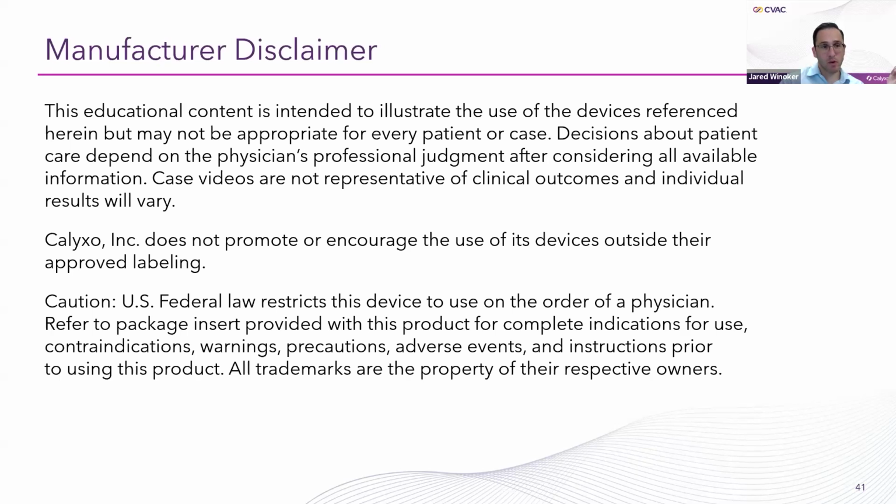laser bridge and start trying to aspirate out fragments can lead to obstructions, but also frustration with the device. So it's meant to be used effectively and properly, even though there is, of course, a range of technique and nuance that you can develop in performing the procedure.